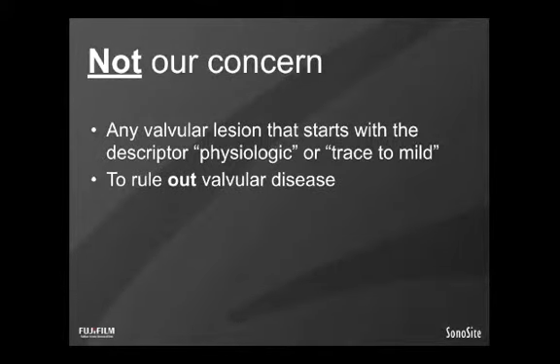Of distinct disinterest to us is any valvular lesion that starts with the descriptor physiologic or trace to mild. Similarly, it is not the objective of the point of care echocardiographer in the most basic sense to rule out valvular disease.